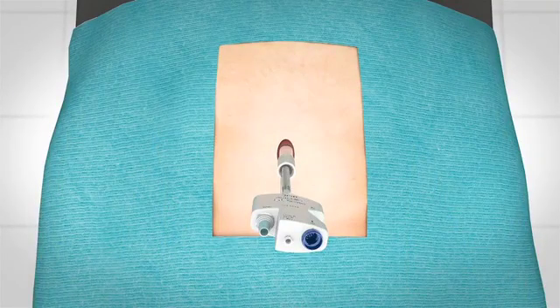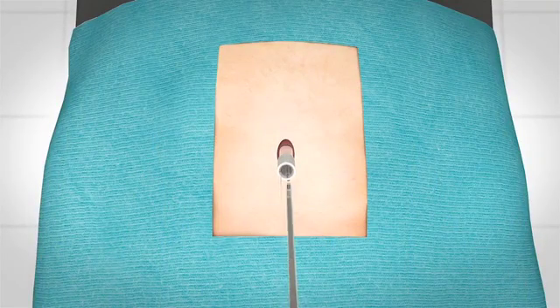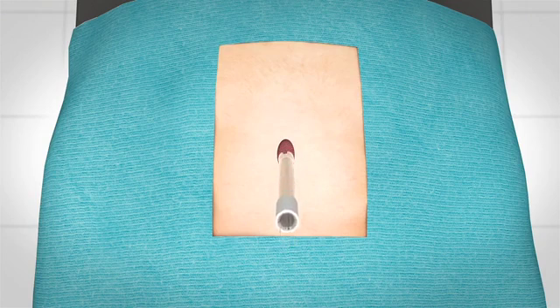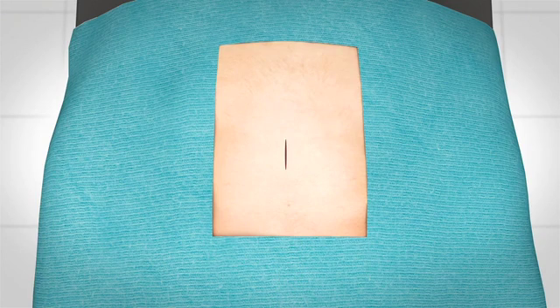After you create all your incisions, you're going to remove the device, remove the cannula, and basically go in and close your incisions.